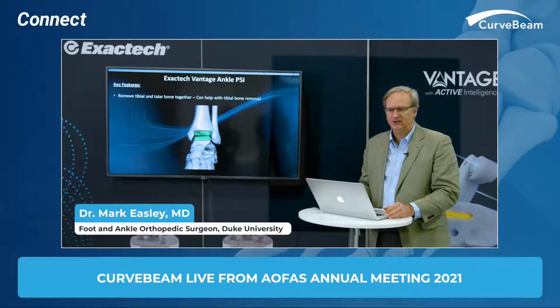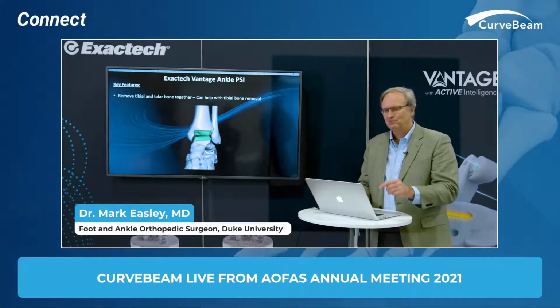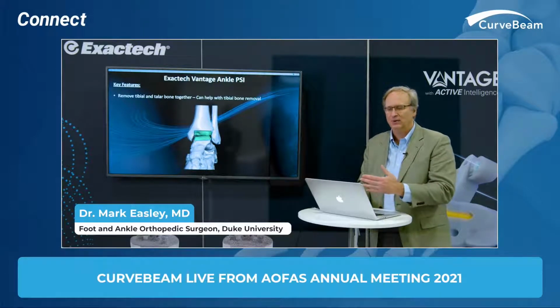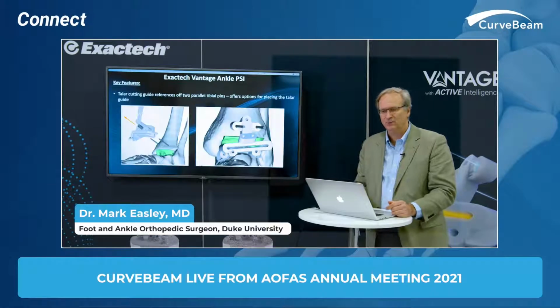And so here you can see where I can plan this. This is through 3D systems where I have the CT scan data, and then the engineers will work to show me exactly where the cuts will be. But this is not necessarily where I have to have it. So I will have an opportunity to meet with the 3D systems team, and we'll work through an opportunity to get it exactly where I want it to be, and then that's the plan I sign off on. We'll go over that in some more detail.